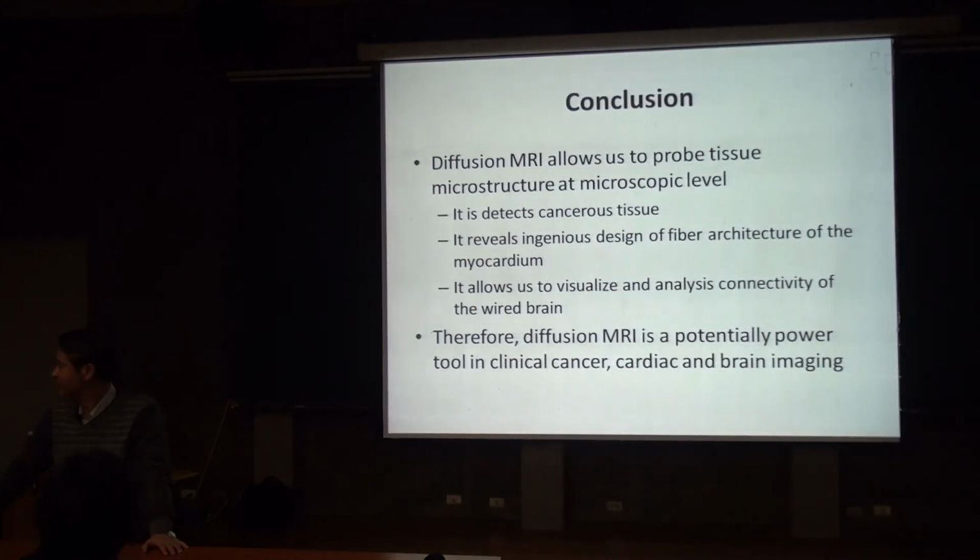What's the resolution? How big a cancer can it detect? I think the resolution is not very fine. But all you can do is detect things like lymph nodes. A lymph node of about 1 to 2 centimeters, I think it can detect whether there are cancer cells or not.